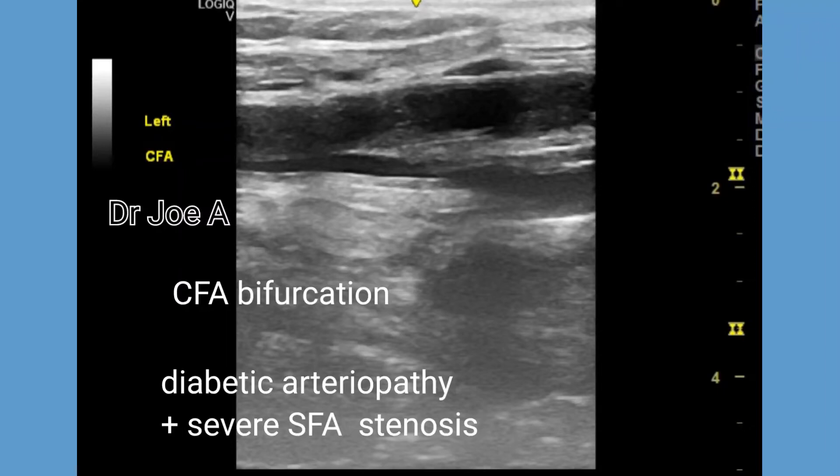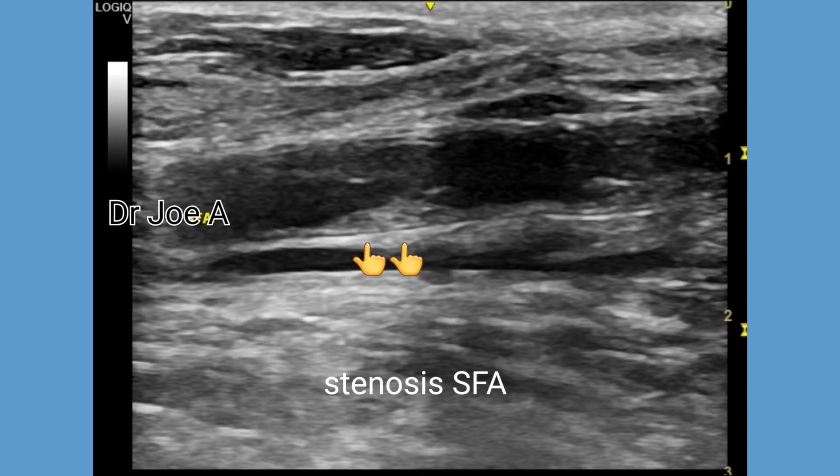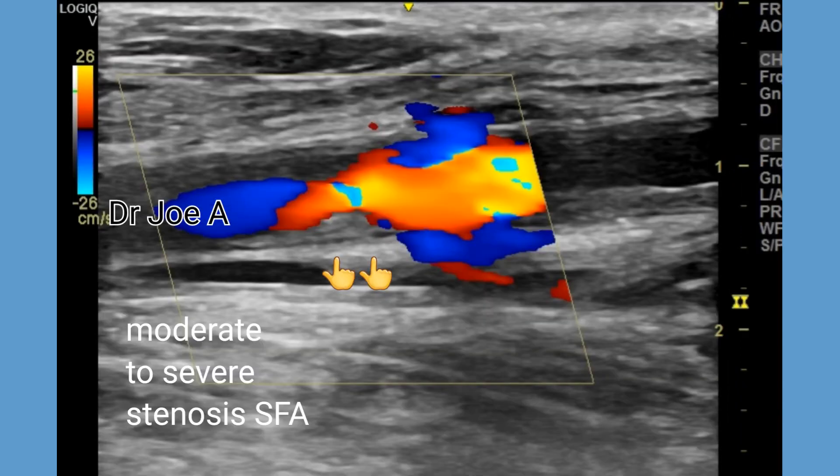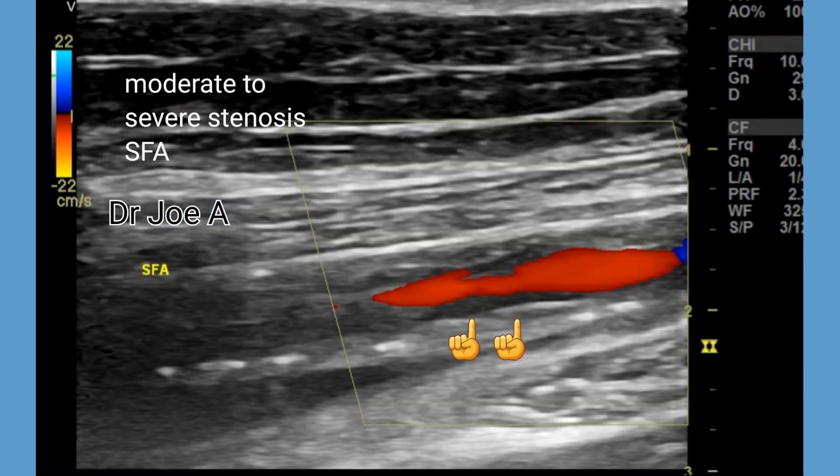This patient has diabetic arteriopathy with severe superficial femoral artery stenosis. Observe the aliasing at the level of the stenosis.